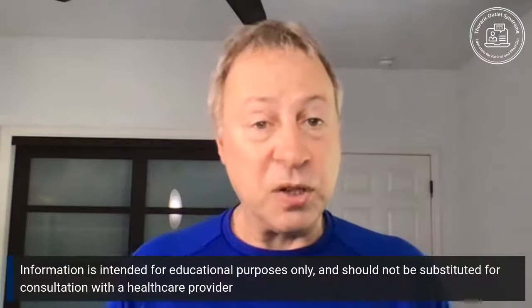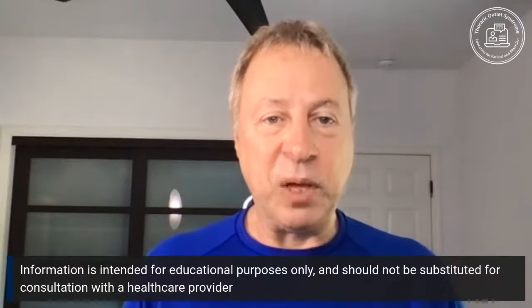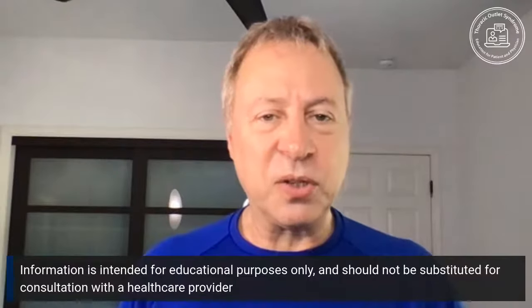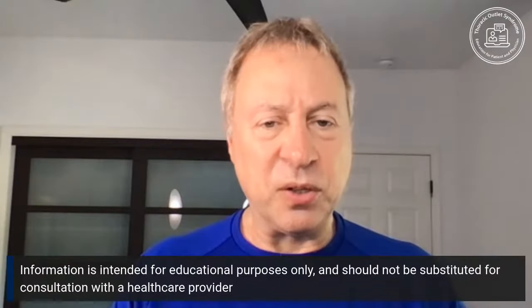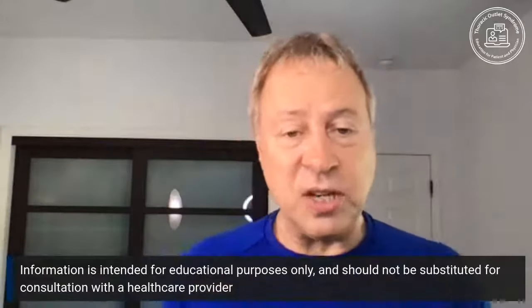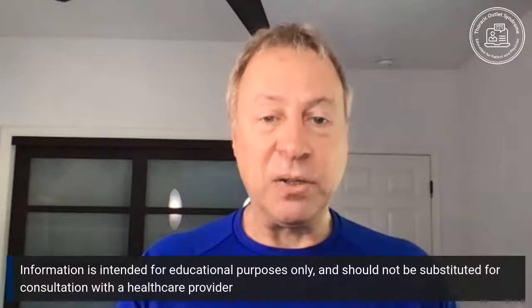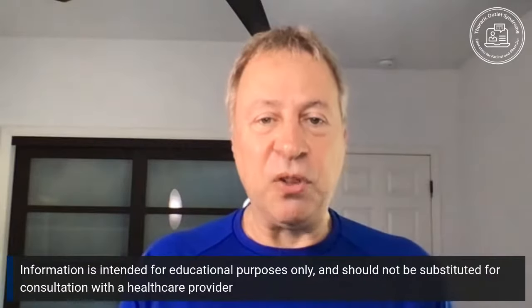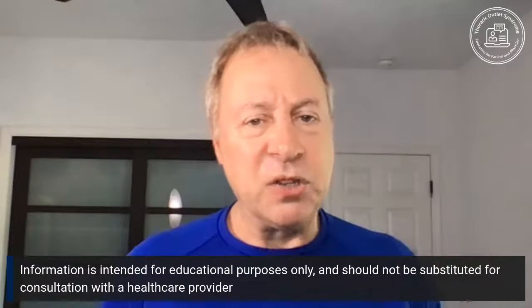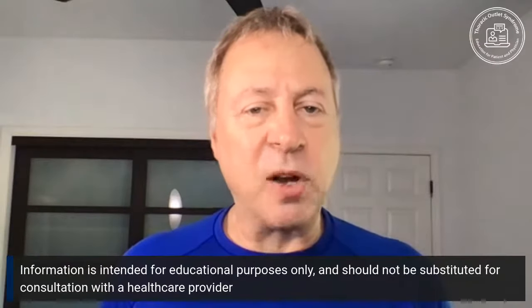You want to see all the muscles, because these muscles form the tunnels that those nerves and blood vessels have to pass through. We know there's a lot of variations, like extra muscles or abnormal insertions of the muscles or intertwining of the muscles with the brachial plexus. So you need to see the muscles. The perfect study would not only show the macroscopic muscle that we're looking at, like if you stood 3 feet away, but would also show us the microscopic features. Is there scarring in the muscle? Is there inflammation? Are there tiny little bleeds from a car accident?